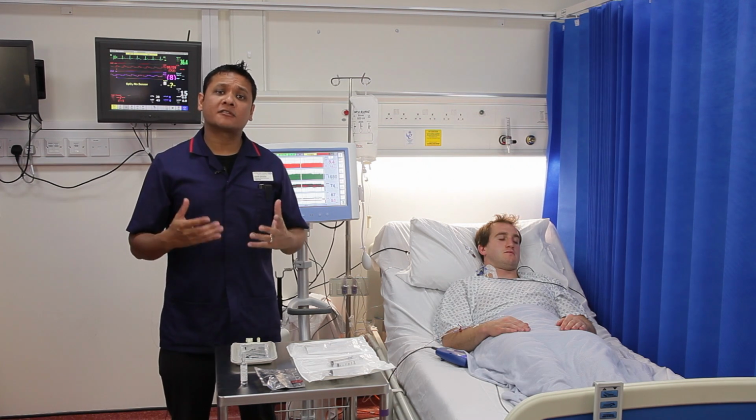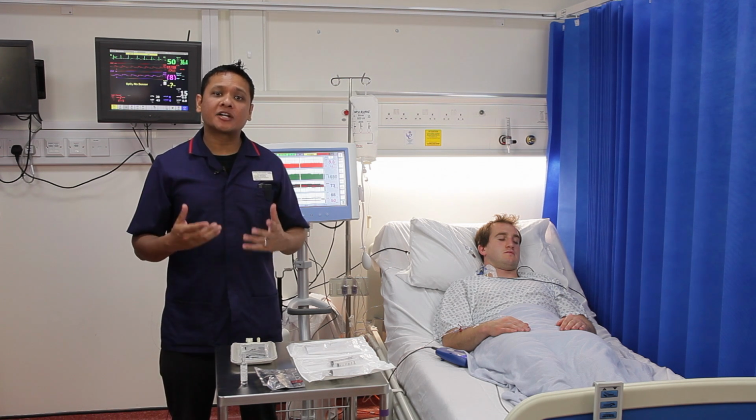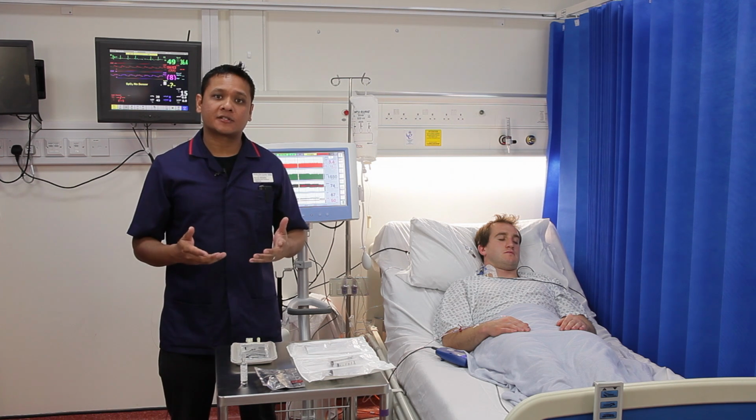Ensure the sensor is free of blood so the sensor can be reused for a later calibration. Re-establish the arterial trace and ensure the trace is optimal as this is required for an accurate calibration. A damped arterial waveform may lead to calibration errors.